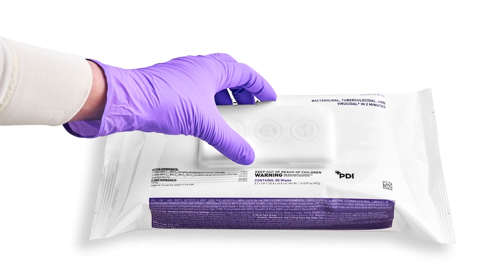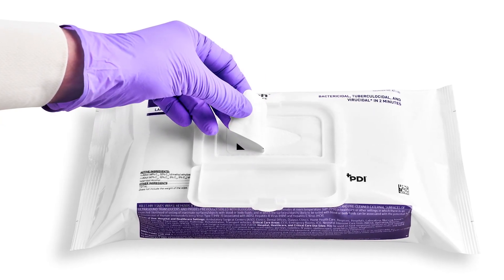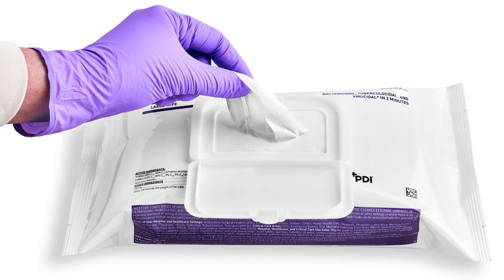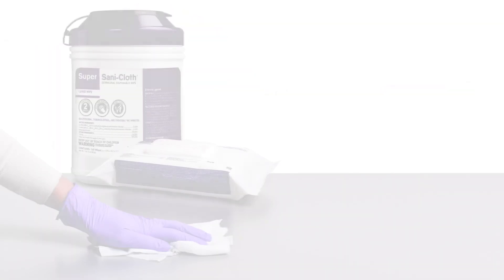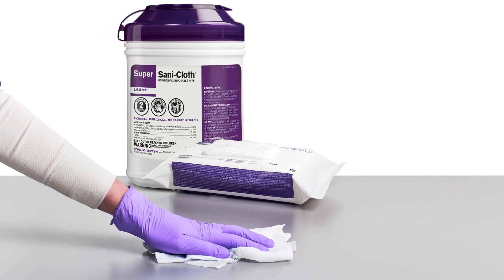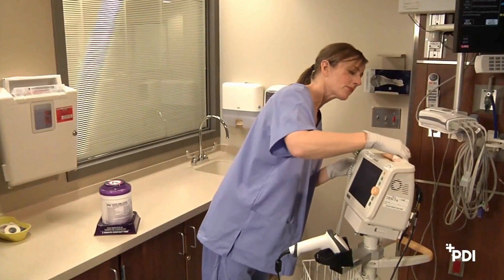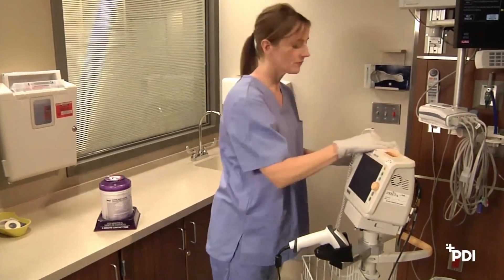To prepare the soft-pack to dispense the first wipe, open the package lid and completely remove the inner seal. Pull out the wipe at an angle through the opening. Whether you are dispensing from a canister or a soft-pack, there is no need to mix or measure. The pre-saturated wipes have the correct amount of germicidal solution, saving valuable time.